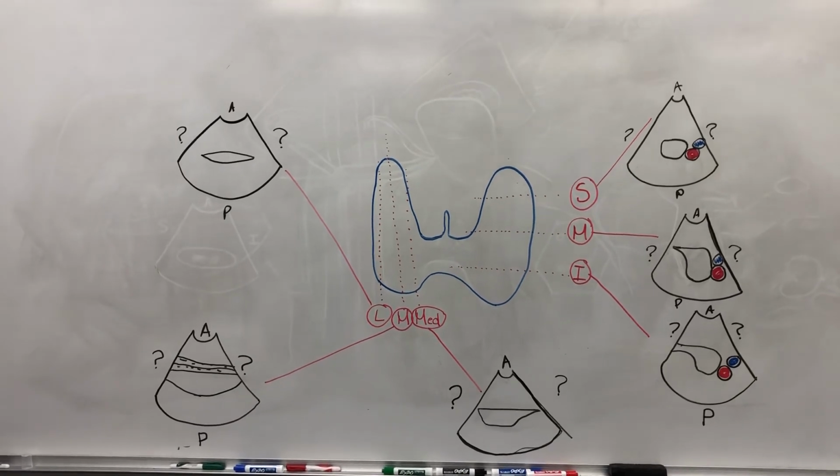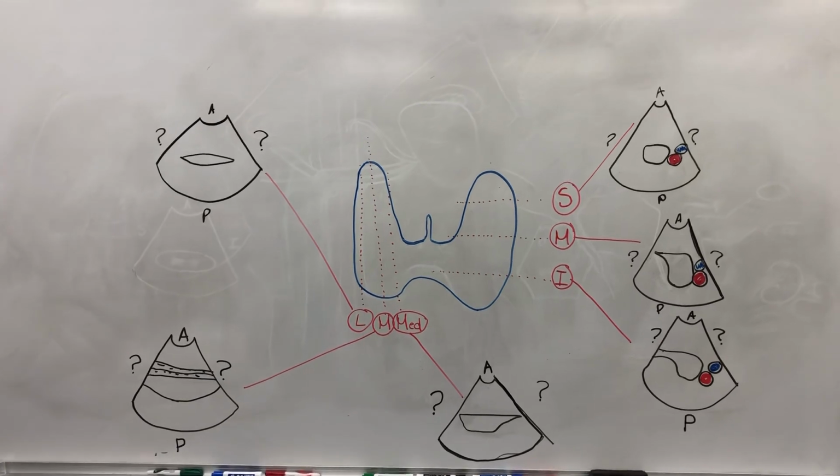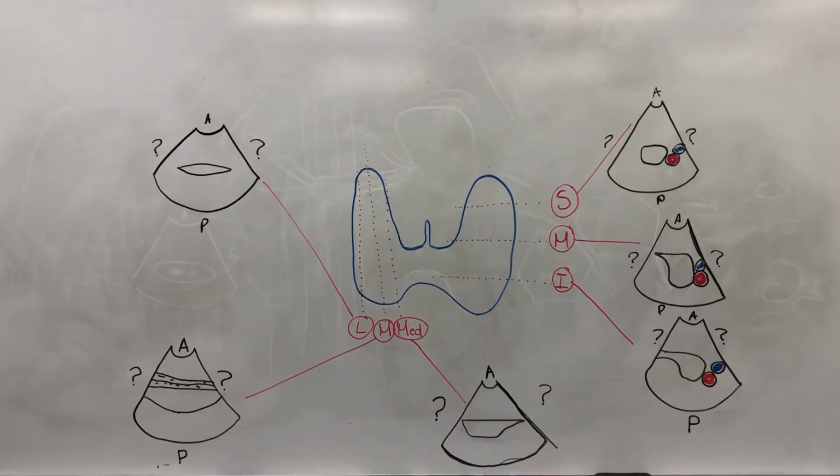So you're going to see essentially the throat or trachea, and then to the left-hand side, in a transverse scanning plane, you will see, posterior to that left lobe, the esophagus as well.